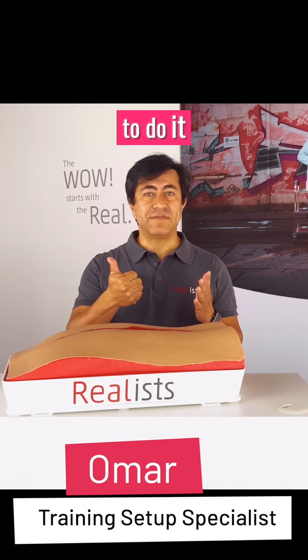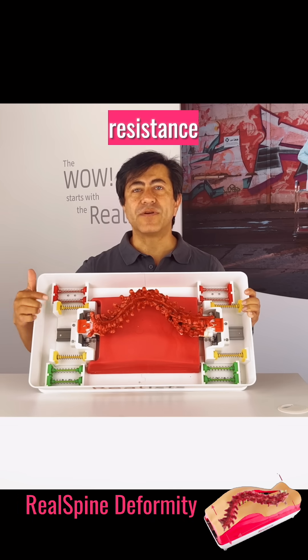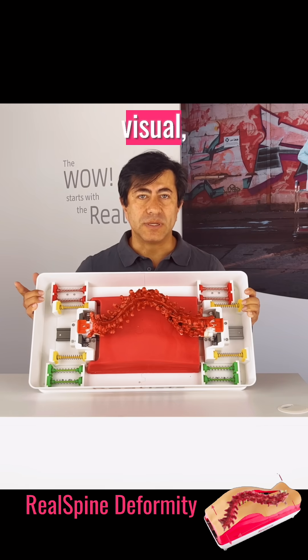You need to train your hand to do it safely, precisely, and without risk to the patient. This spring simulates the resistance of a rigid spine. Every correction feels real — it's not just visual, it's tactile.